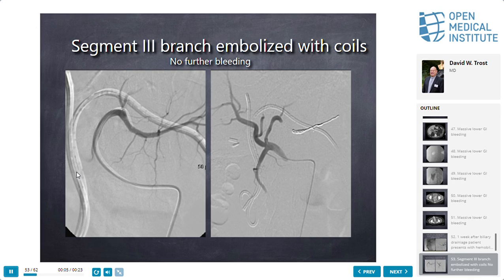And again, the same way with the kidney one. If you don't see it, you can't figure out what is the cause. You can take the tube out over a guide wire. A lot of times that will open it up and then let you know exactly what is bleeding. So this one, it bled, the tube was left in, and the patient did well.